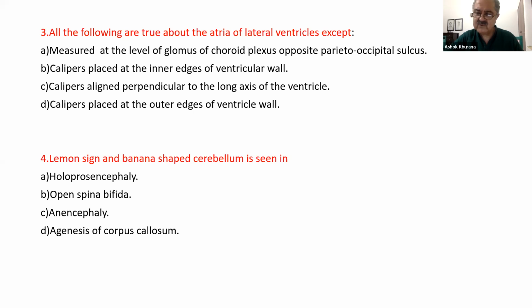and say, look, we have a marker here. We should use it. We should train our mind to say, okay, this is not ovoid. This has a bump in the front, and I don't see the wonderful kind of cerebellum that Suchita has shown us today, and therefore I must refer further. So we really must have this, and I'm so glad Dr. Hasmukh has brought this up, that we should not waste years, and every obstetrician must learn to do at least basic ultrasound and preferably move on very rapidly to advanced ultrasound.